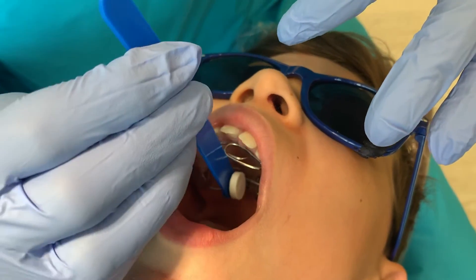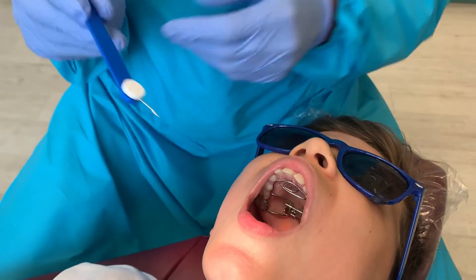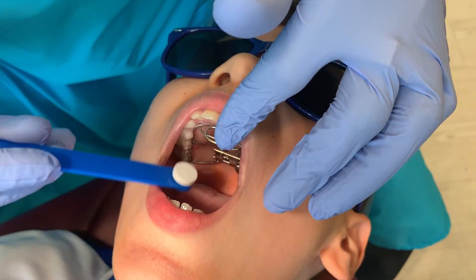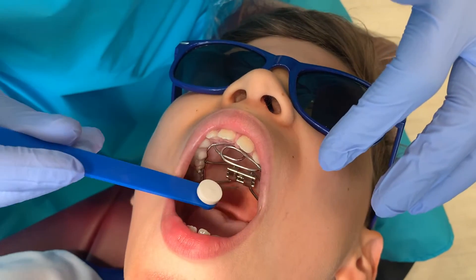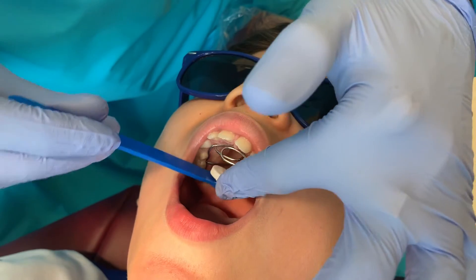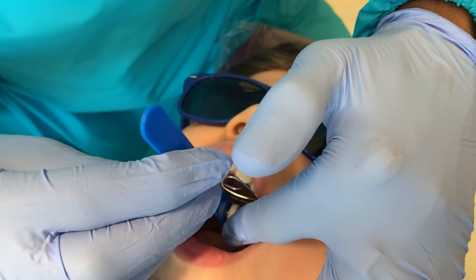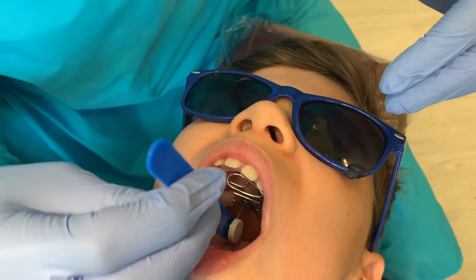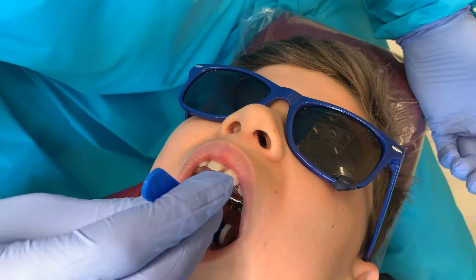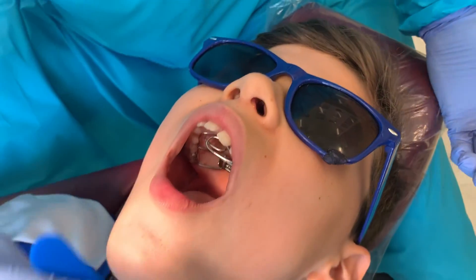So I'm going to redo it again. Keep it at 7:15, and you will see the hole in the middle line — there are three lines, the one in the middle has the hole. You come in at a 45-degree angle, and as soon as you see the hole, take your left pointer finger and kind of help push it in. Once pushed in, you turn it this way and push it backward — and that's one turn. Then you just wiggle the key out towards the back of the mouth and take it out.